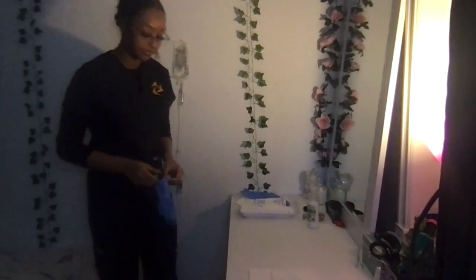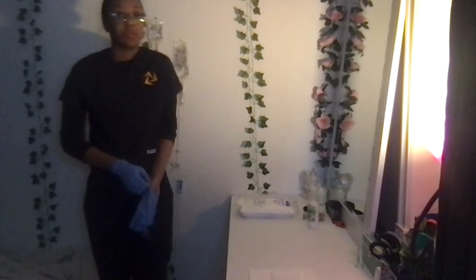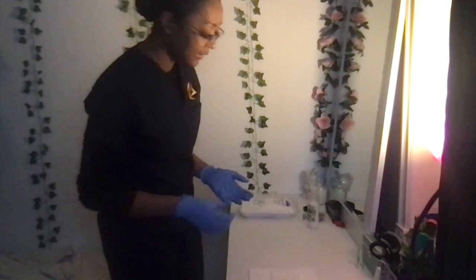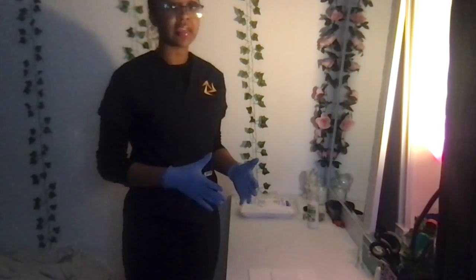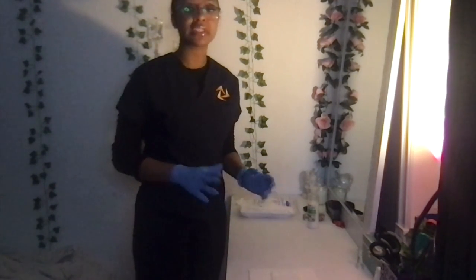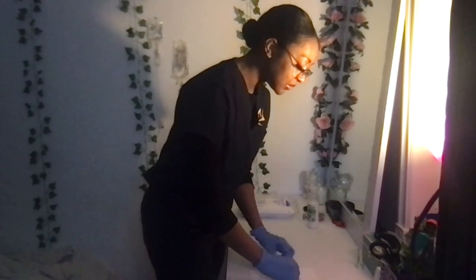Okay, now I can perform hand hygiene and put on clean gloves, like so. So once I put on the clean gloves, then I can take off the old dressing parallel to the skin of the wound, and then parallel to the growth of the hair so that I'm not pulling on the skin and the hair, and I'm going to pull towards the incision so that it reduces any pain.